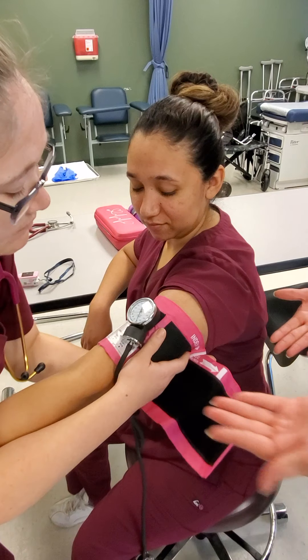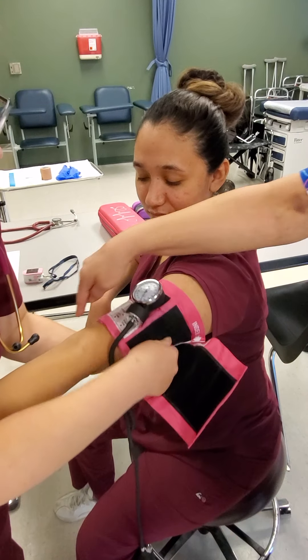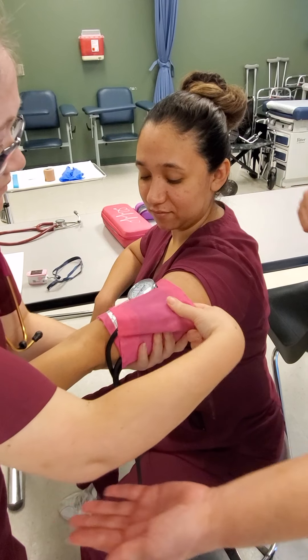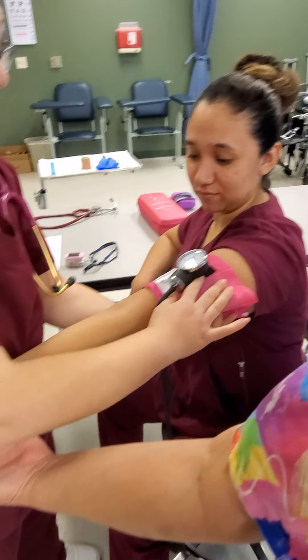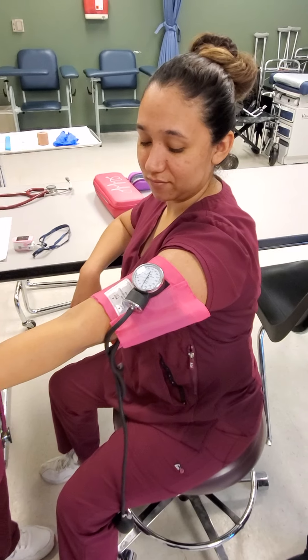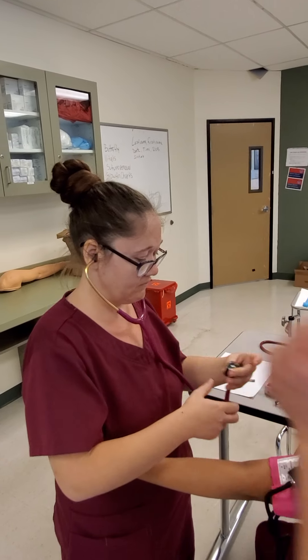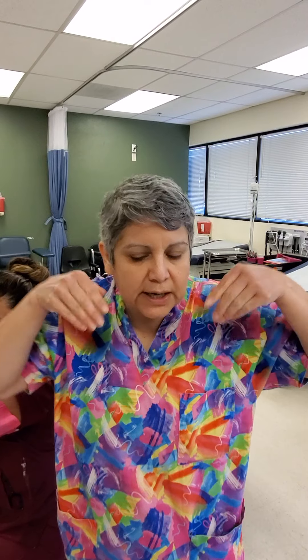You also want to make sure your patient's arm has palm up — it opens the antecubital fossa area. As you can see, she's going to hold the patient's arm at heart level. Her stethoscope's ear pieces are turned facing this way because as adults, our ear canals go this way, and you want to make sure you're able to get in and listen.